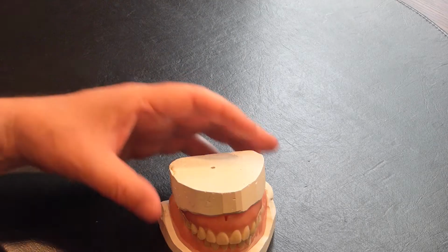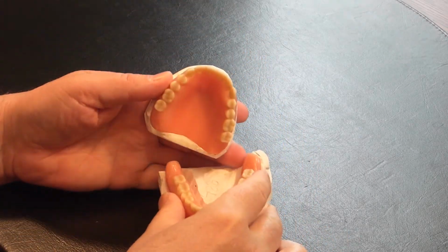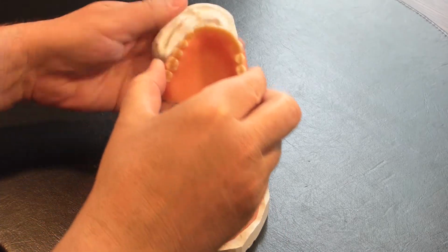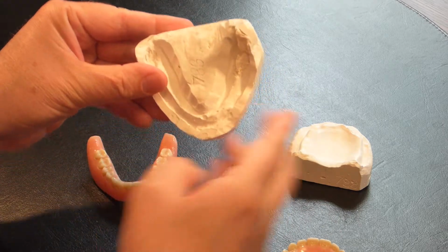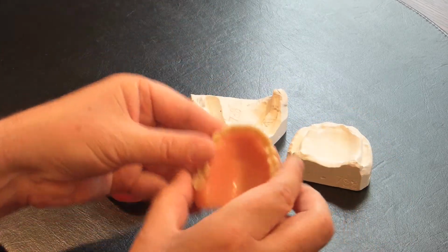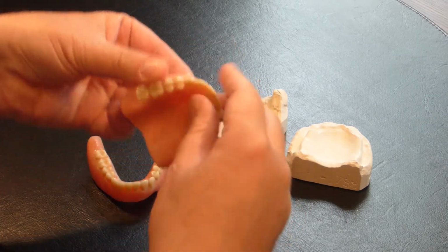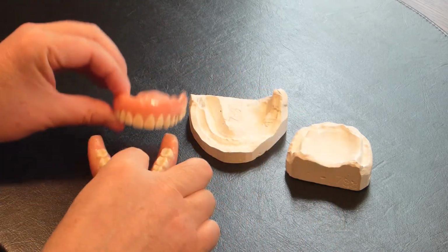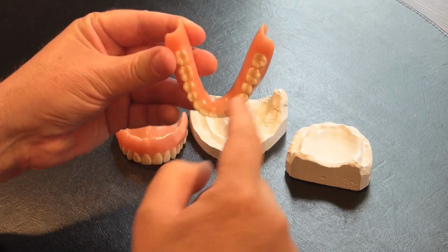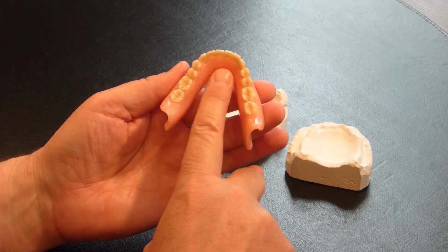Today I'm going to talk about what a denture is. So this is a set of upper and lower full dentures. These are just plaster molds that they sit on. So the upper denture, you can see, covers the roof of the mouth, while the lower denture is horseshoe shaped. This leaves space for the person's tongue.